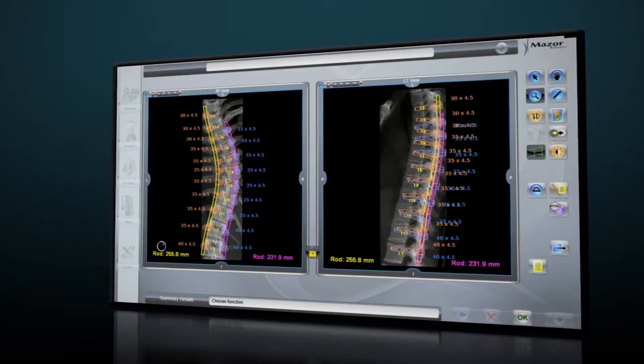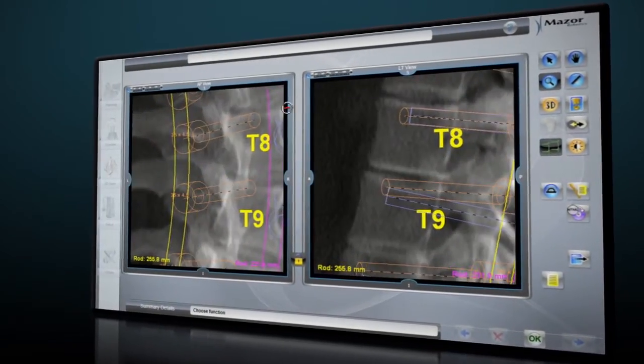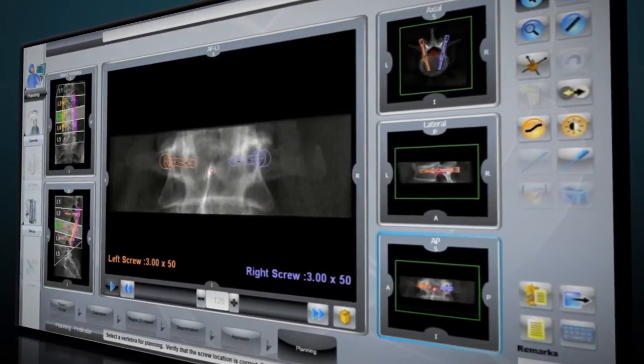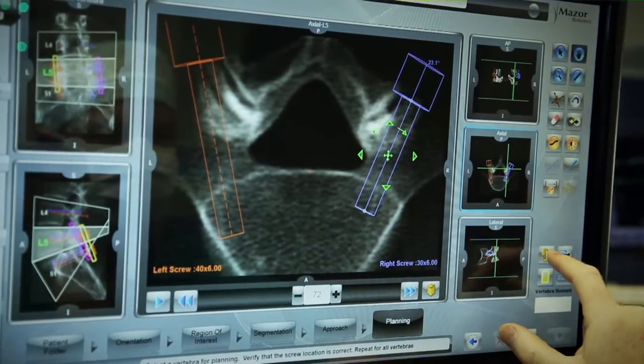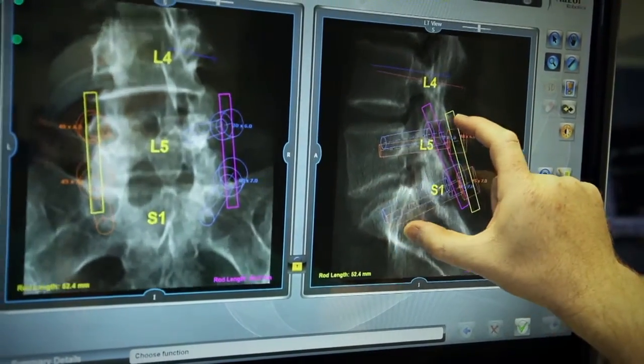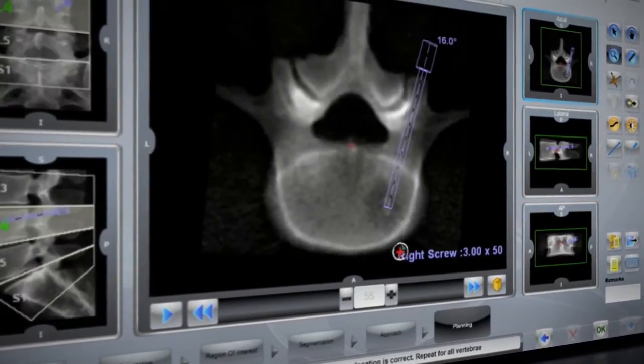Renaissance's interface allows you to review and modify this plan in axial, lateral and AP views until you are fully satisfied with the location and purchase of the implants or trajectories from other procedures such as vertebral augmentations and biopsies.